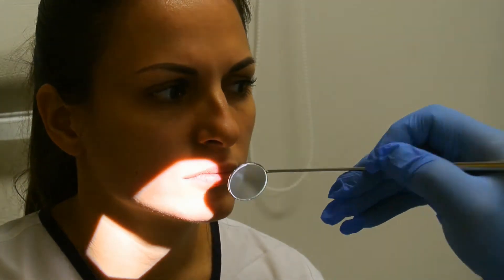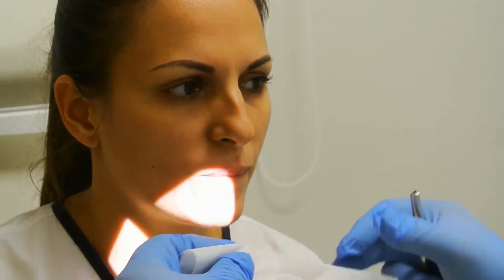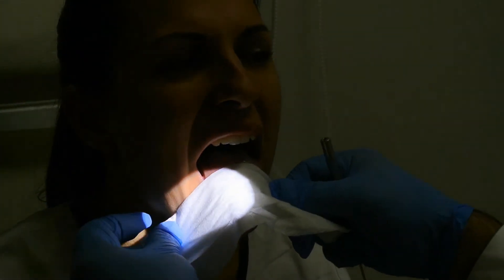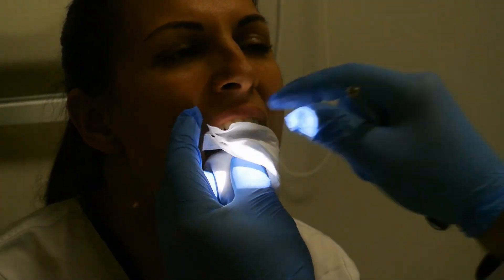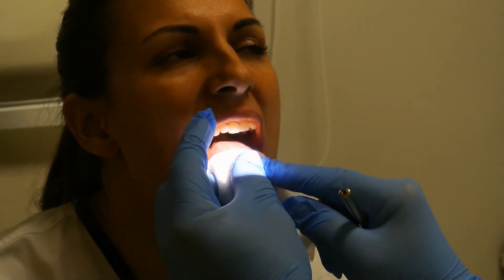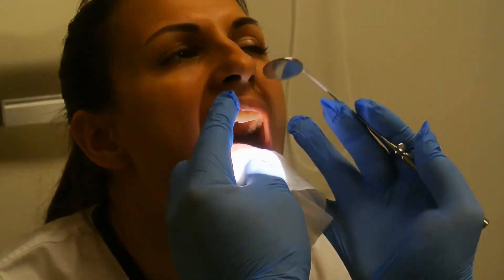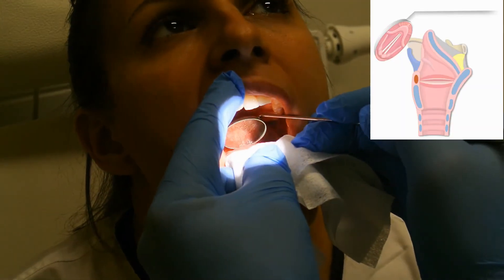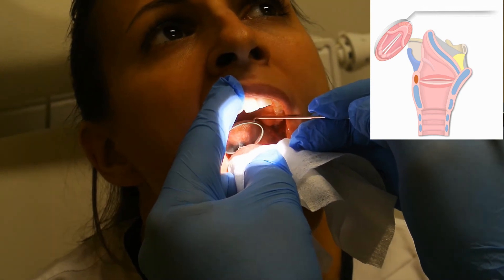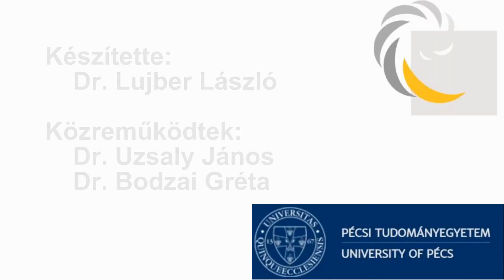We should introduce the mirror from the side, from the angle of the mouth, otherwise we would block the view with our hands. We should also take care that the swab wouldn't fold up and block the view. We can introduce the mirror from the side and secure our hand even on the patient's face while moving the mirror.